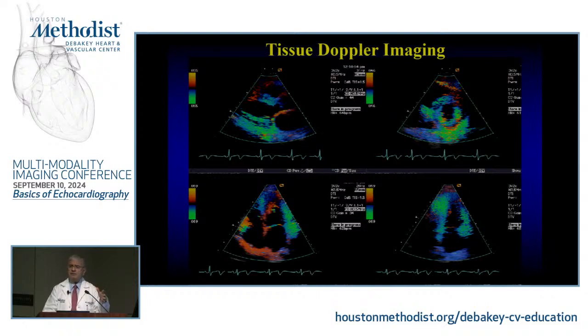Most of the Doppler that you've seen ignores tissue. And it's interesting. We grew up without looking at tissue Doppler, color Doppler at all. It's very interesting because blood and tissue have different characteristics for the Doppler effect. In the tissue, the signal intensity is much higher and the velocities are much lower than in the blood, where the velocities are much higher and the signal that you reflect because of the red cells is much lower. So you could put a filter and say, I don't want that versus I want this. You could separate them very nicely.